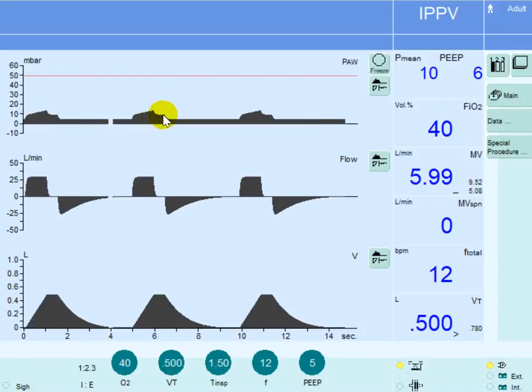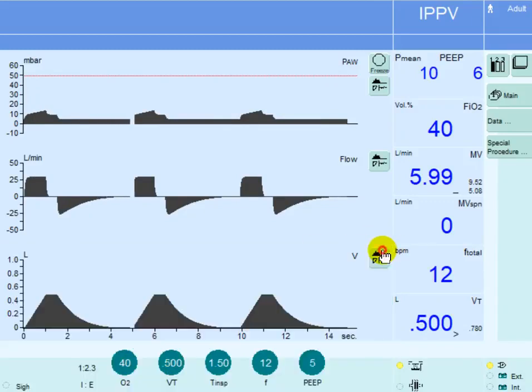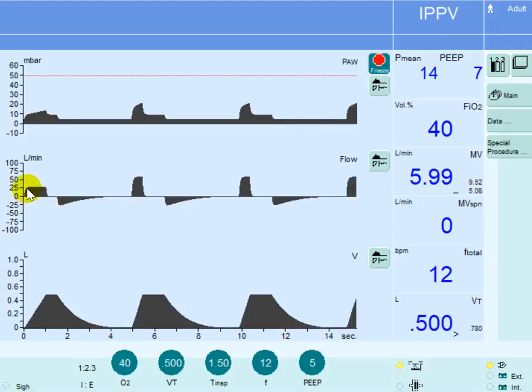Now we need to see what will happen if we change that flow rate. I'm going to increase the flow rate from 30 liters to 60 liters — doubling the flow rate. Let's freeze it here and notice the difference between the first breath and the second breath. The flow rate was 30 liters per minute and now it's increased to 60 liters per minute.